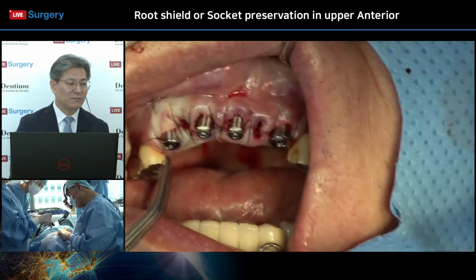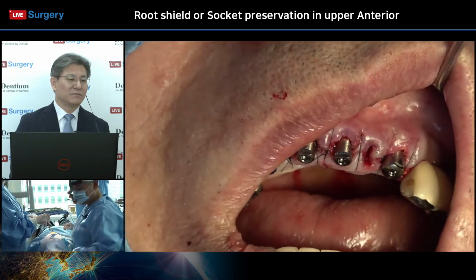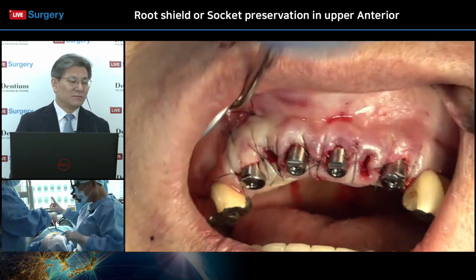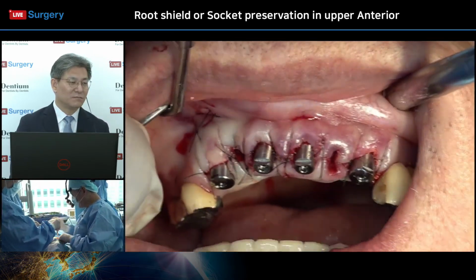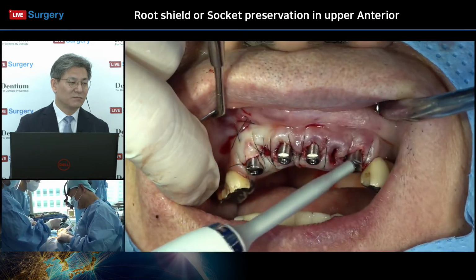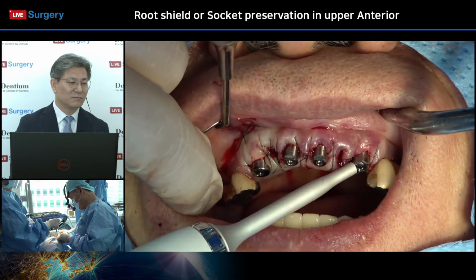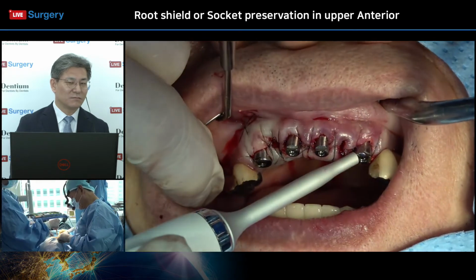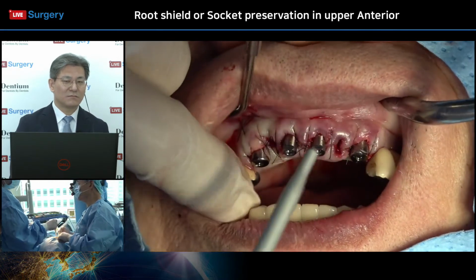Very fortunately we have some flat surfaces on the labials, but still the stability is lower. So for the temporaries, maybe 3 to 4 weeks later, the number 53 will still be a little bit lower, so still lower for the temporaries.